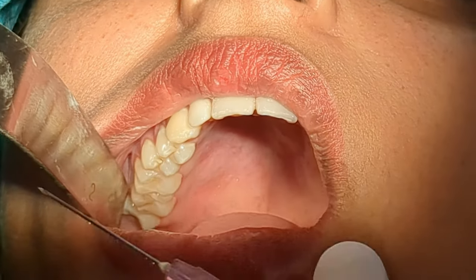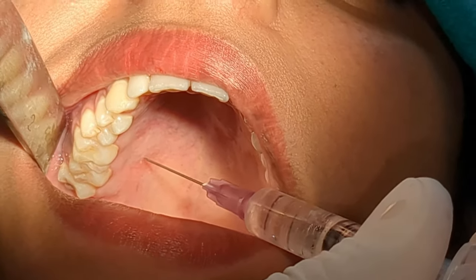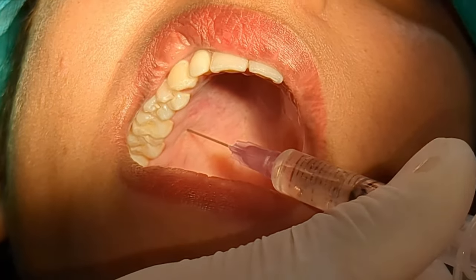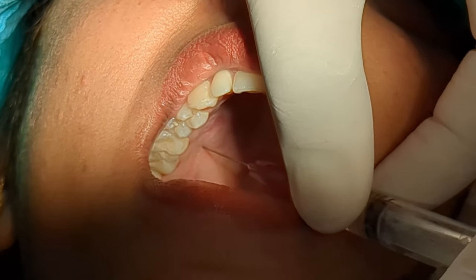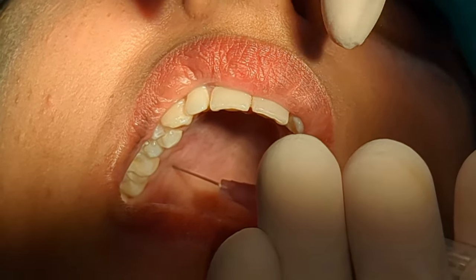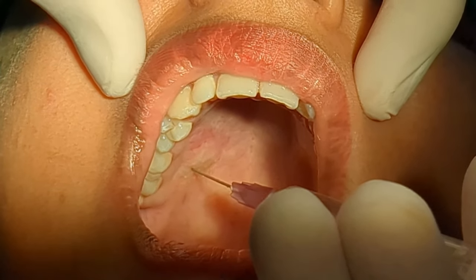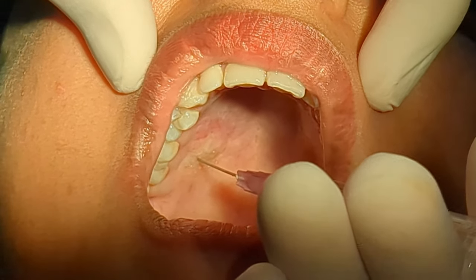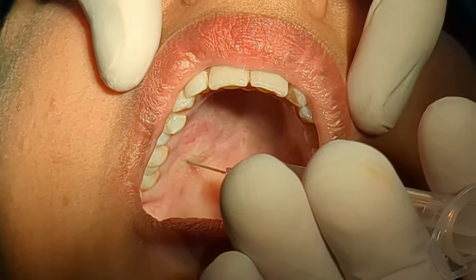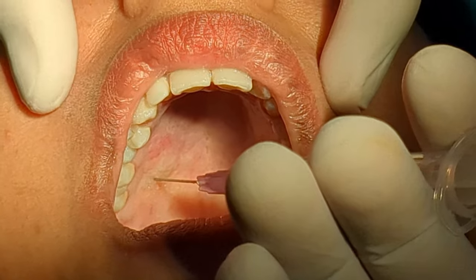You are supposed to approach the greater palatine foramen from the opposing side, and the bevel should be towards the bone. Now I am going to aspirate — the aspiration is negative. Biplanar aspiration again negative. The amount of LA to be deposited at the greater palatine is 0.4 to 0.6 ml in a normal individual, and this is more than enough. You can see the bulging of the soft tissue and slight blanching.